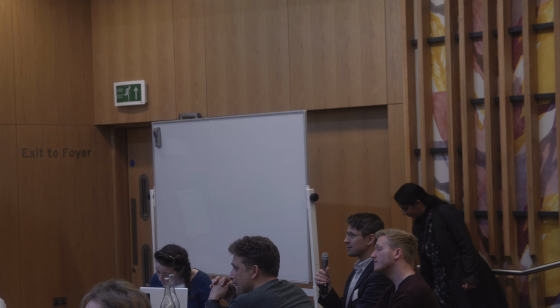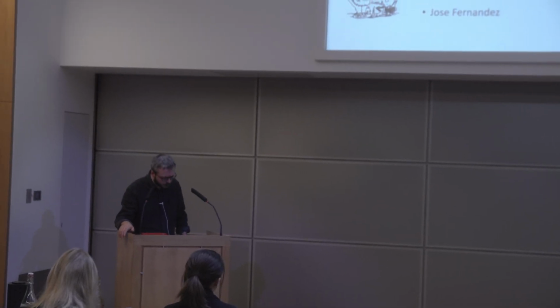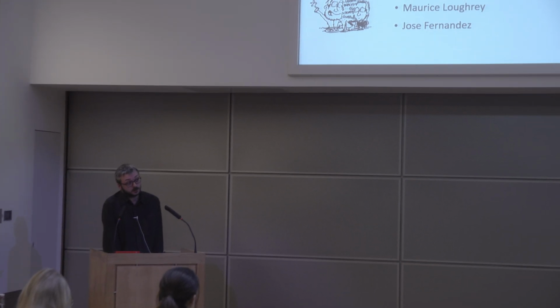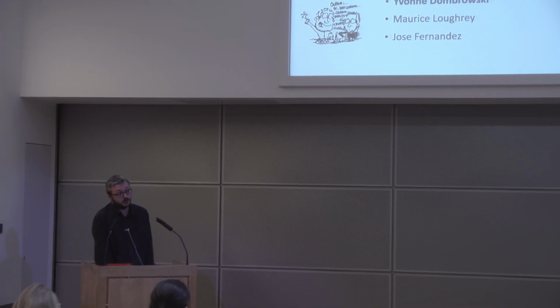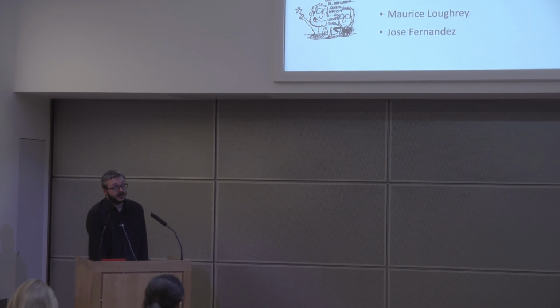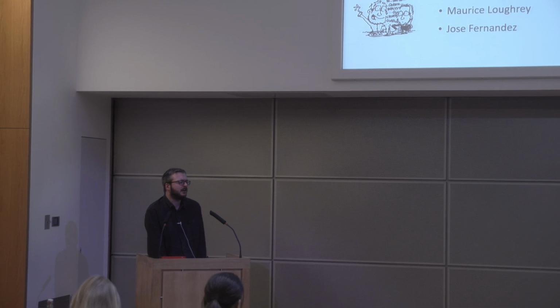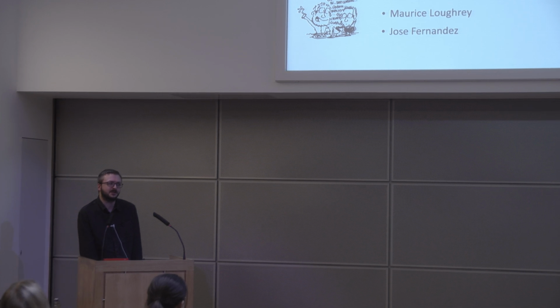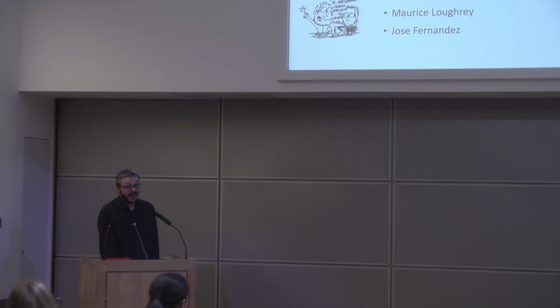So I received some contact about spatial transcriptomic support within QuPath. It's just I've never actually seen or worked directly with the data sets myself. But from how it was described to me, it sounded like it's something that it certainly could be adapted to handle. But as I say, a lot of it is developed to the problems that I faced and the data sets that I received, and also had a justification for spending time working on.